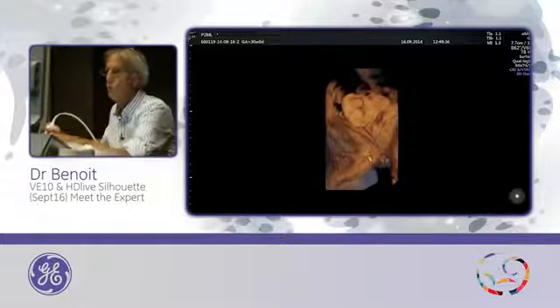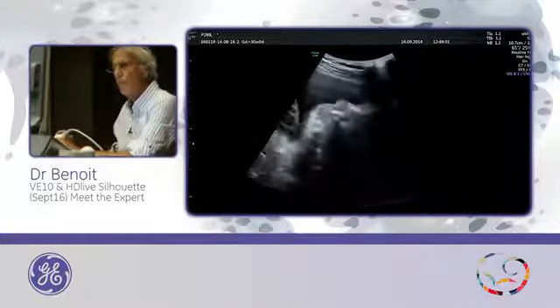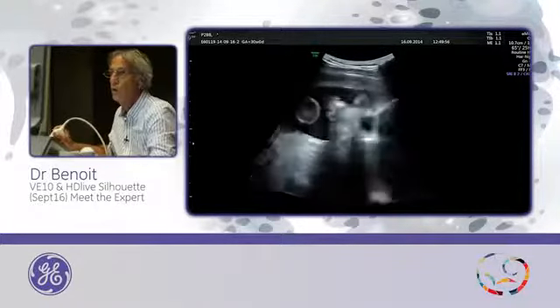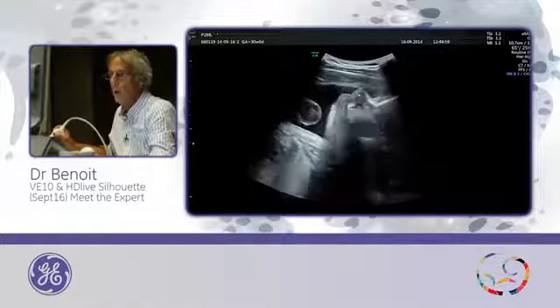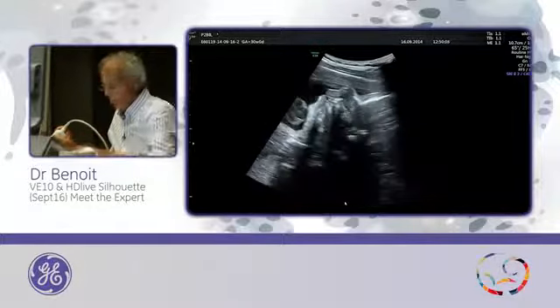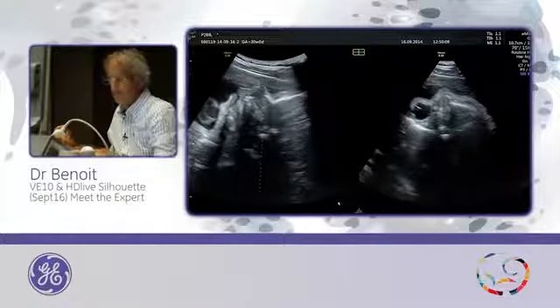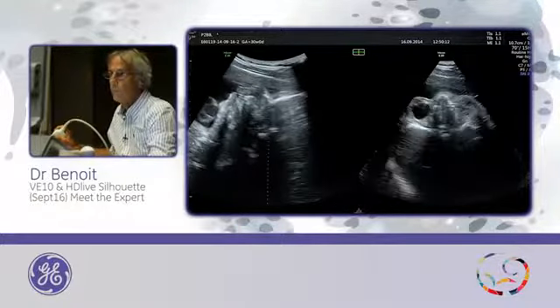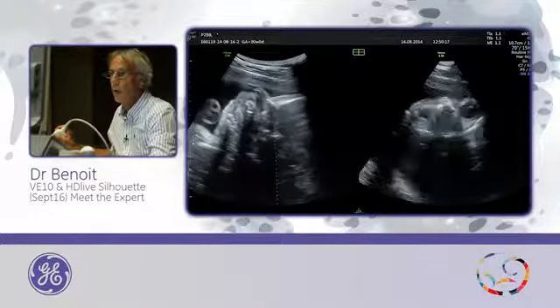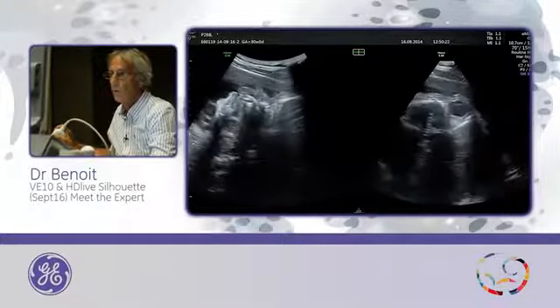And I will show you how to use a new HDlive. So now the baby is not in the perfect condition for the 3D, for the face. Why? Because we don't have too much fluid in front of the face. So I will demonstrate now the use of the B-plane. B-plane, it's here. So if you move this line, you have here the two orbits. That means if you start from the profile on the B-plane, you can obtain the two orbits.